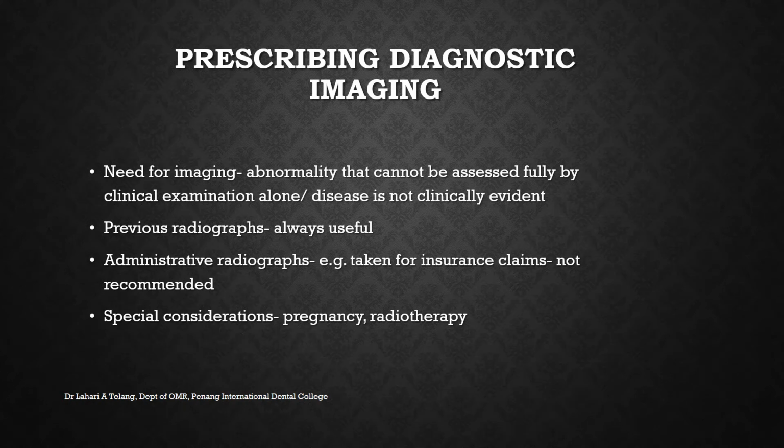When we're talking about prescribing dental imaging, there are certain important points that need to be kept in mind. Number one is the need for imaging. Do we really need to take an X-ray for this particular case? And if yes, which is the kind of radiograph that would be useful? For example, when there is an abnormality that cannot be assessed fully during clinical examination alone, or when the disease is not clinically evident, it's important that imaging comes into play as an aid to diagnostics, and X-rays are then of help.